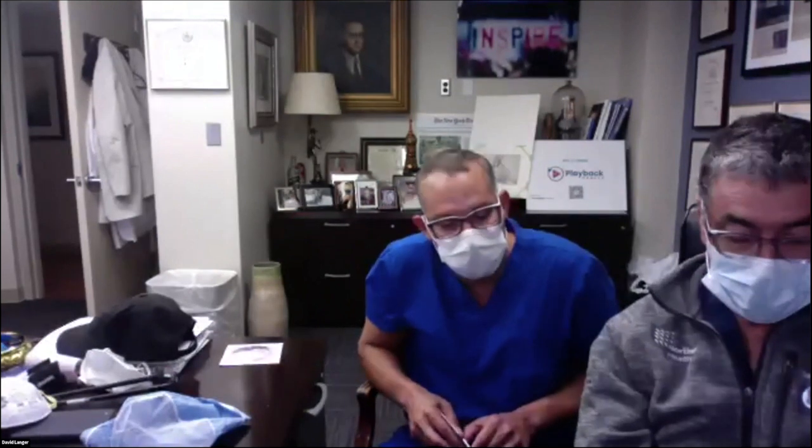So at the end of the day, it went well. The aneurysm is secured. We're keeping her on heparin, which is a blood thinner that we give through the vein, an intravenous blood thinner. She will remain on that overnight, just as a precaution. And then tomorrow we can stop it, and we'll see how she's doing.